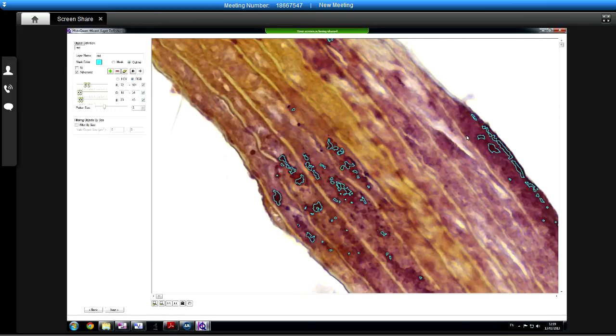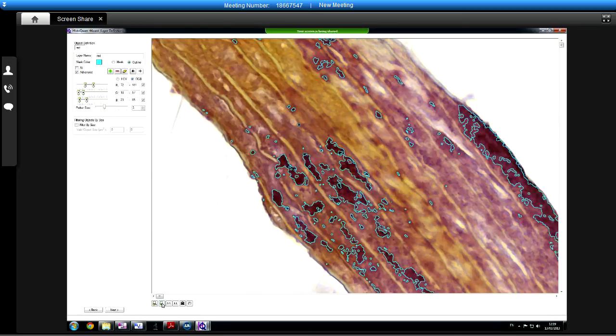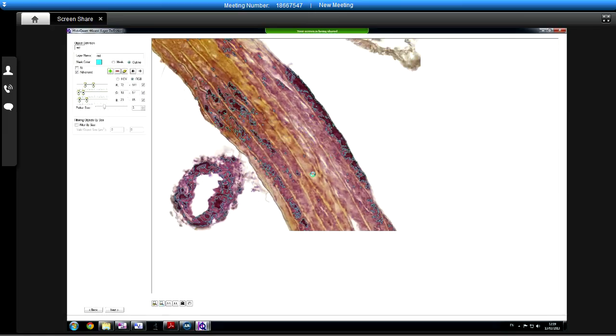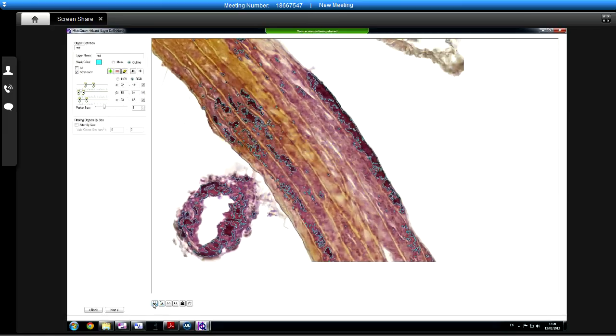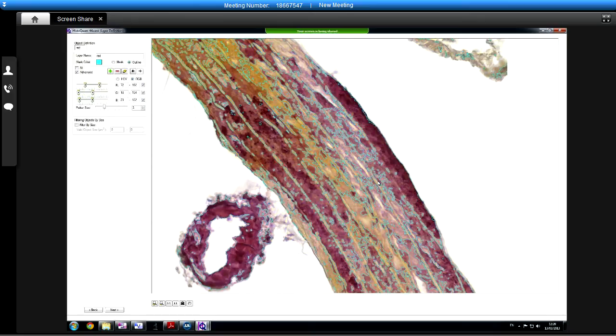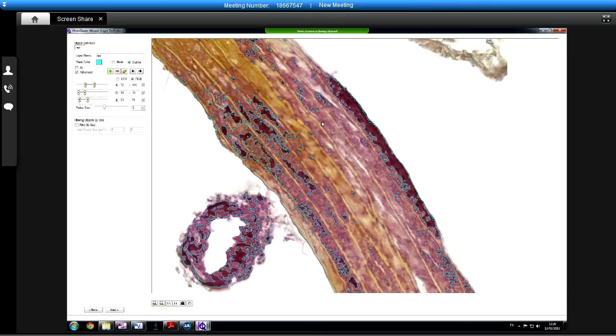This red was true as well, wasn't it? This stuff here. Yeah. This is looking a bit more hopeful, maybe. So as soon as you try to do this lighter stuff, it picks up all this, doesn't it? It's quite red. I mean, probably this stuff here I could ignore, but this is definitely true, isn't it?